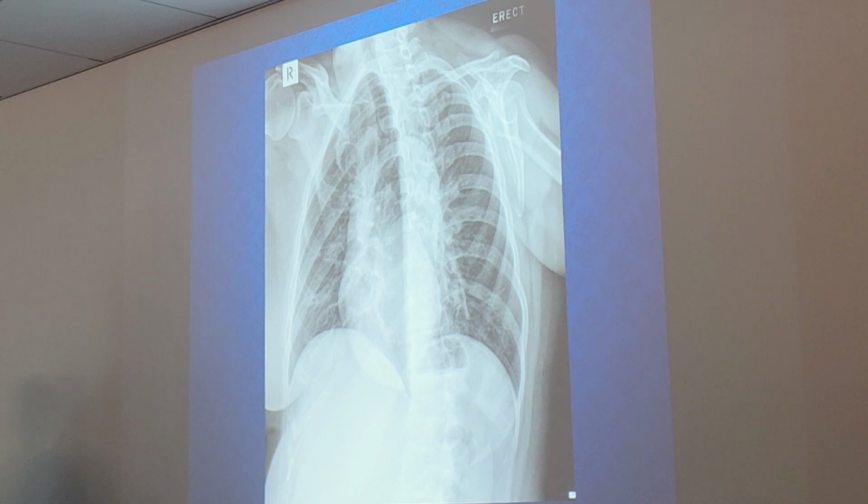I think the rule is, whatever side is closer to the IR should be marked, period. That's also the side that's elongated. No. Depends on if it's an anterior or posterior oblique.